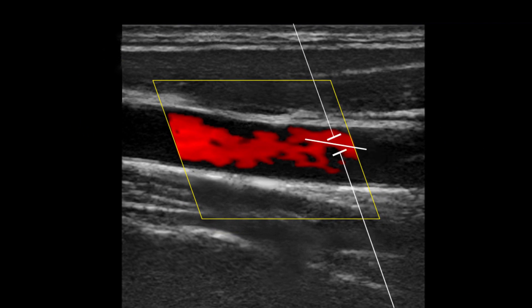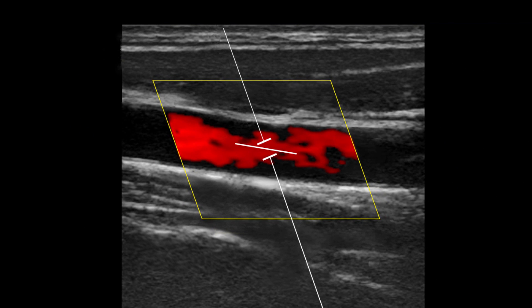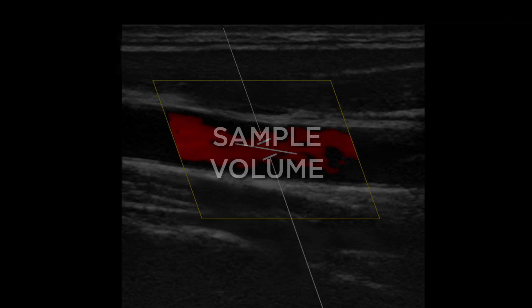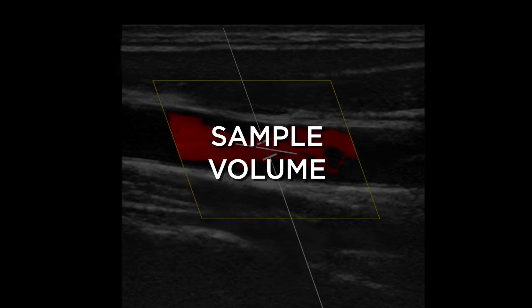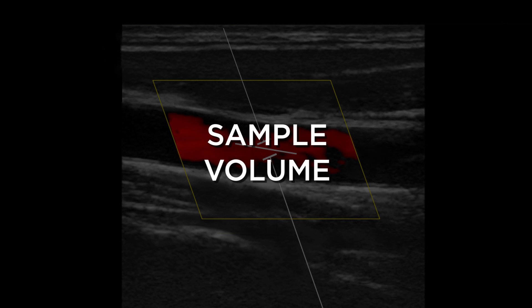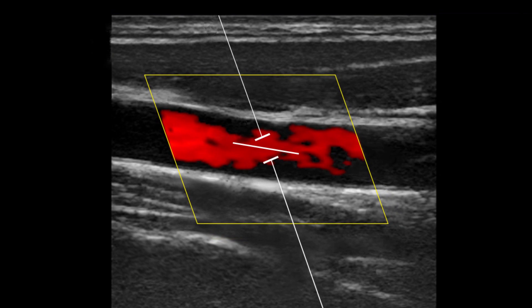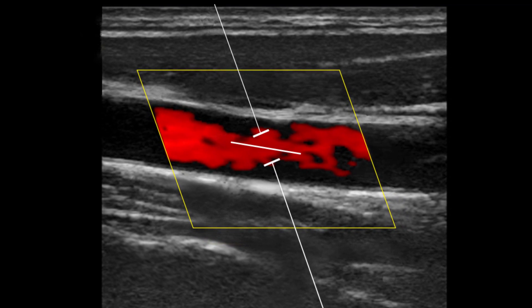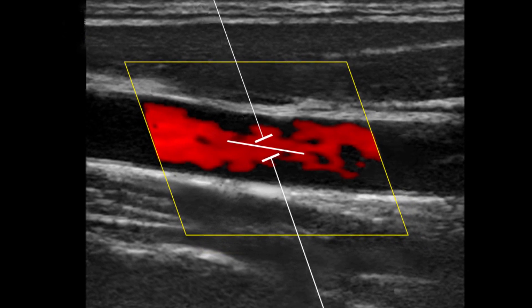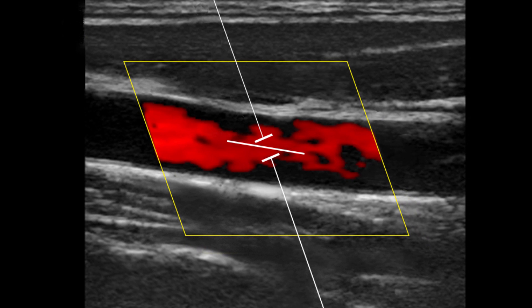First, the Doppler sample volume gate should be positioned in the center of the lumen, or in the area of highest velocity. Next, adjust the sample volume. The sample volume is the area of flow that will be represented in the waveform. The sample volume size should be set to approximately one-third of the vessel diameter.